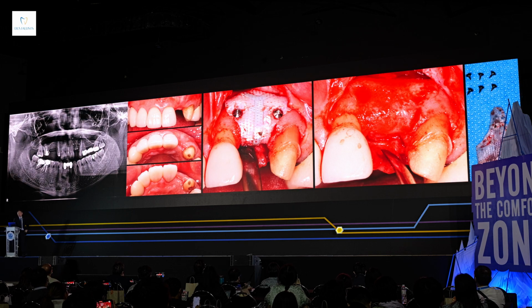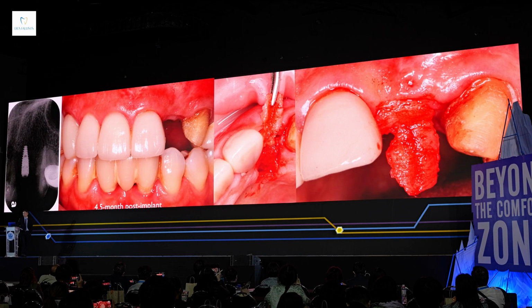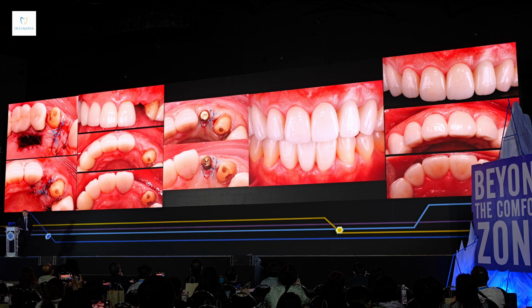Well, in 10 months, I was able to have this type of bone augmentation. And it's not a problem for us to place the implant in the correct position and angulation for aesthetics. And of course, I did another contour augmentation, and then soft tissue grafting with roll technique. And this is the final result.